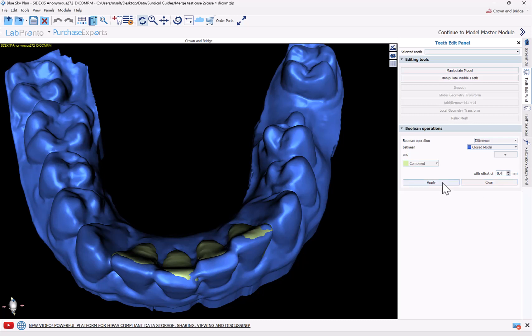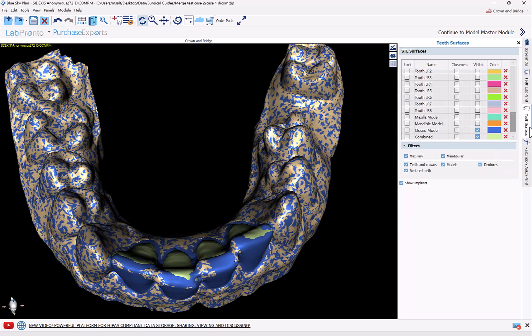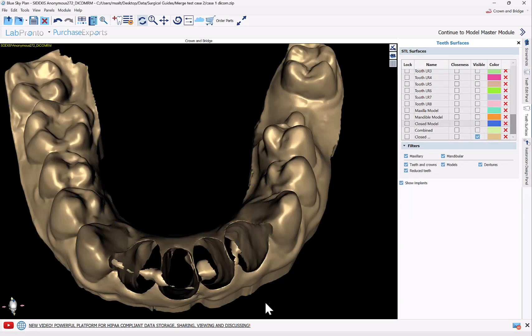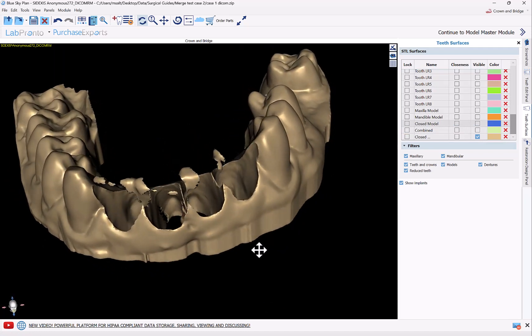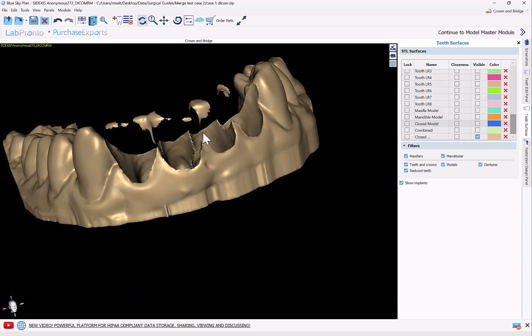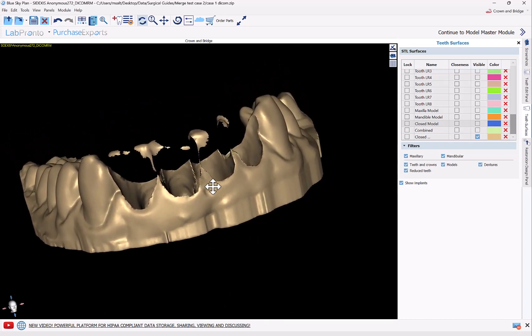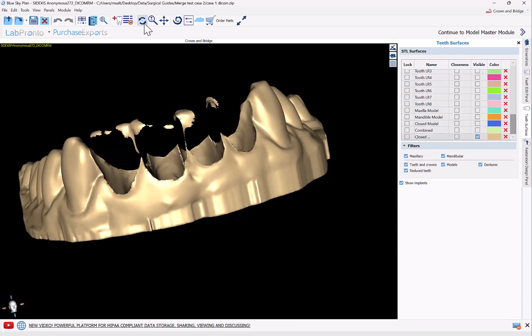If I go ahead and click 'Apply,' it runs the boolean and we have a new surface. We can see that we've extracted the teeth and we have the emergence profile. We still have these little pieces floating here as remnants. Maybe if we had changed the offset to 0.5 or 0.6, we'd have gotten rid of these — but they aren't an issue either.